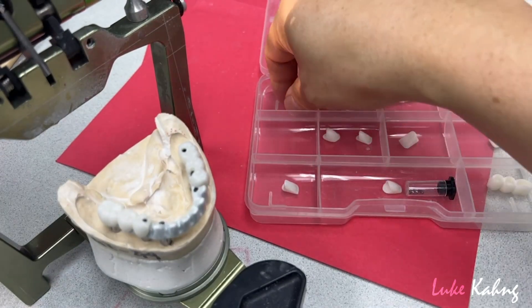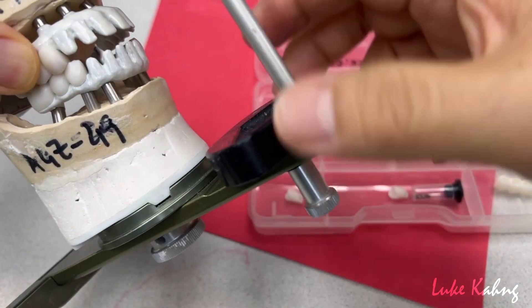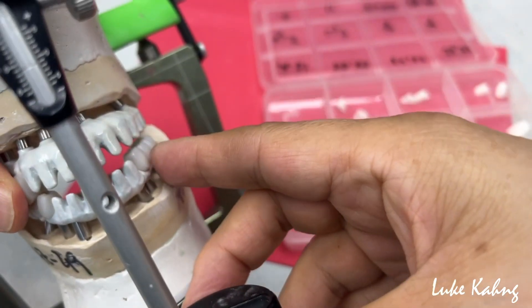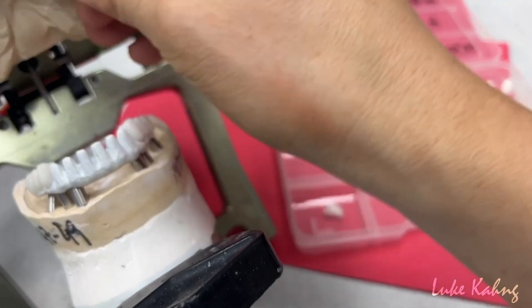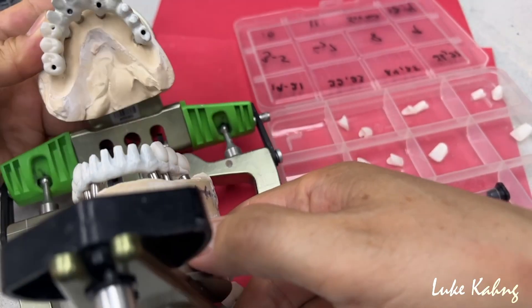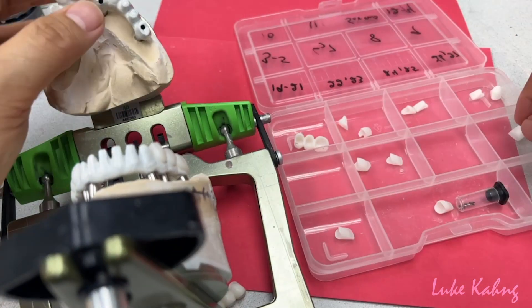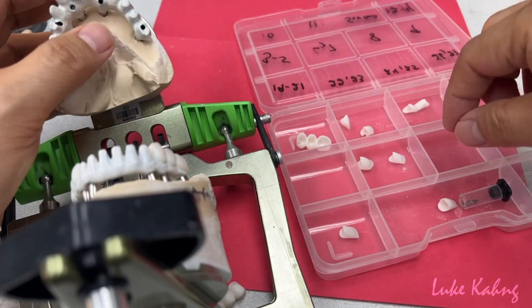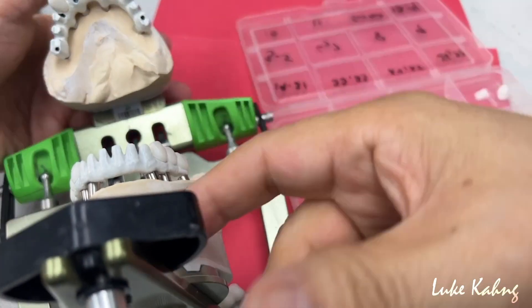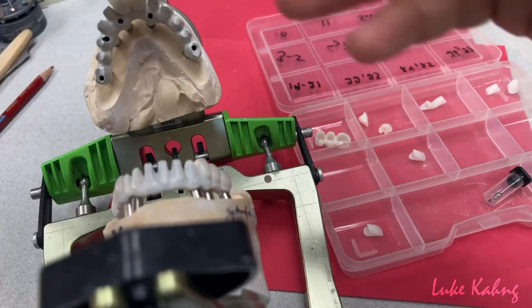Then we narrow down to the tooth number. Together, then we can get a good opposite contact. This is what I double check before we move on to the final work. So posterior is mono and then the anterior is layered. Just like this. So we're going to put the central canine like this, so we get the occlusions contact as well. So this is the concept.